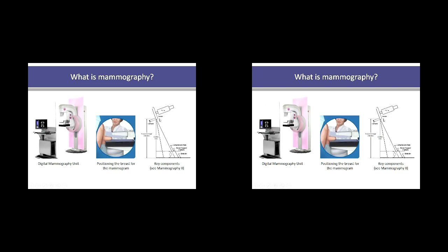This is just showing it schematically then. So at the top we have the components of the X-ray tube. What we have that's absolutely vital is the compression plate. Then we have what we call the breast support platform. And under that then will be the detector. So there will be a grid and a detector under that. And I'll cover all of those components in more detail tomorrow.